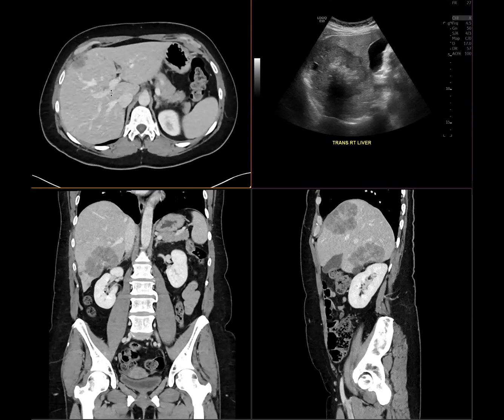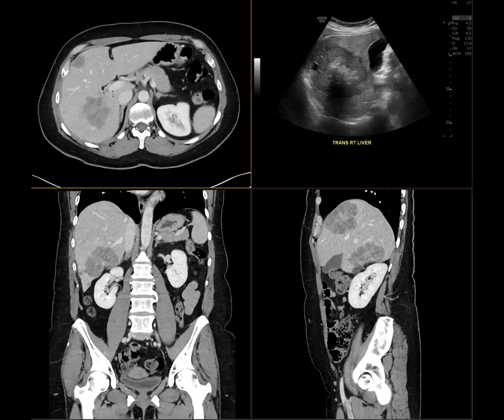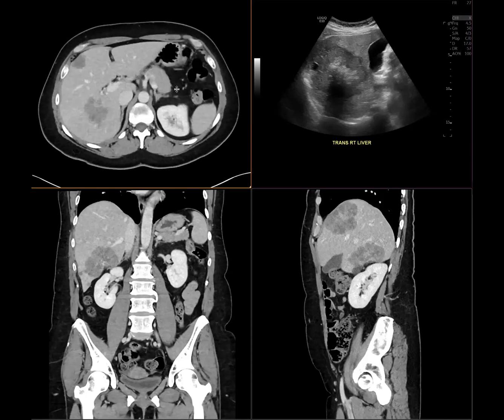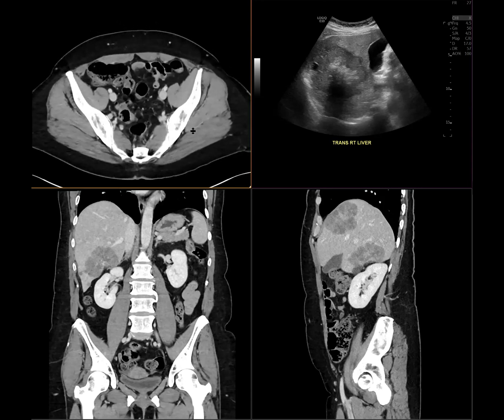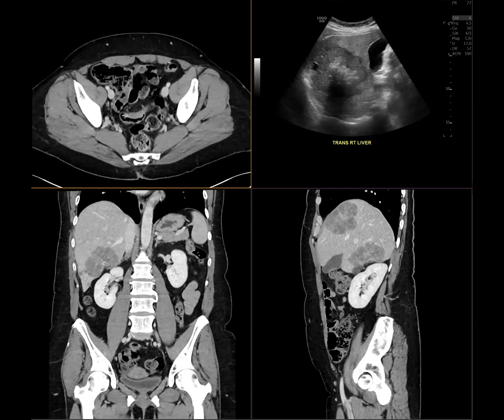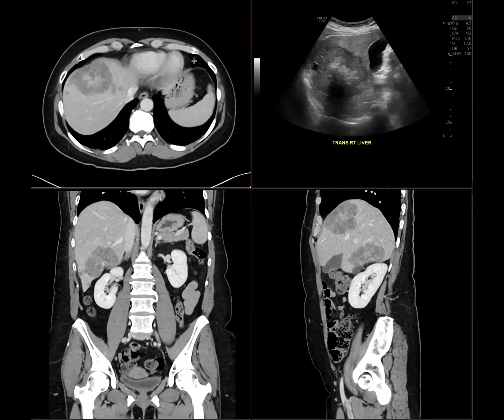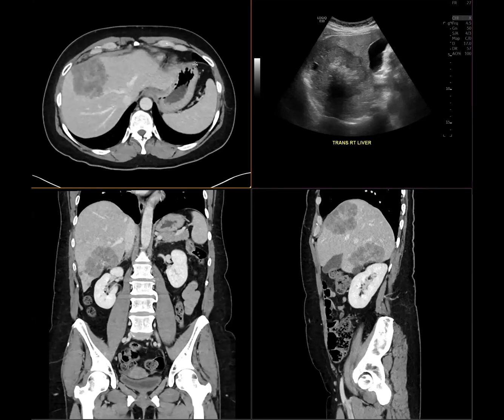These are malignant. They are metastatic, but the astute radiologist who looked at this case actually noticed the calcification, thought about a potential GI primary in this patient who previously had breast cancer, and was then able to find a lesion here in the GI tract. Subsequently, a colonoscopy was performed, and this lesion was biopsied, and it came back as adenocarcinoma. So these are metastatic lesions secondary to colon cancer, to this very invasive colon cancer.